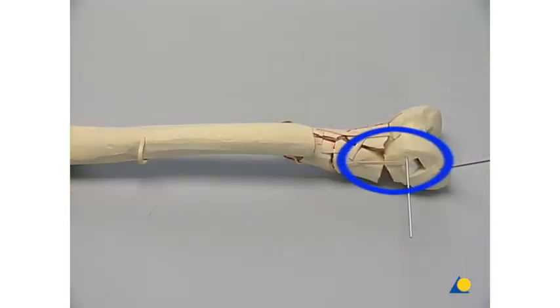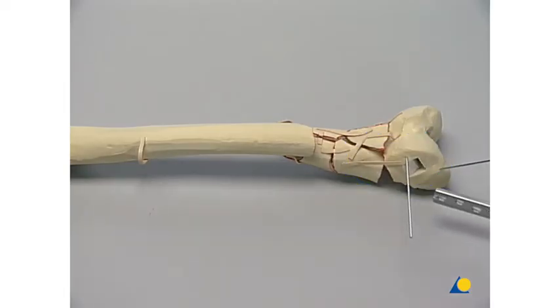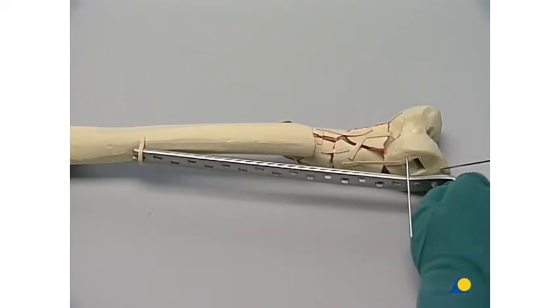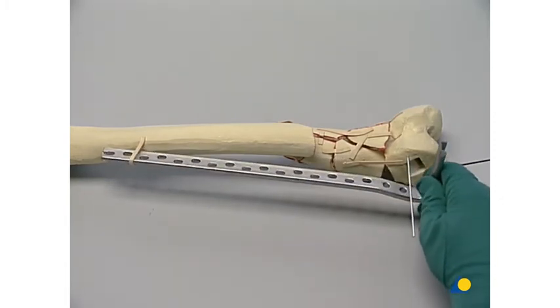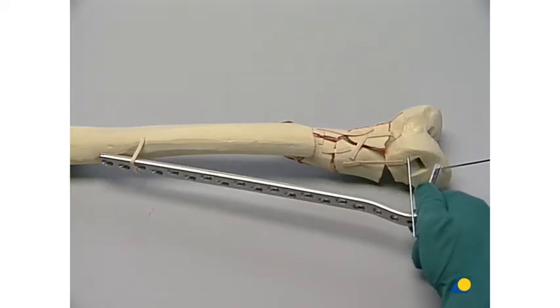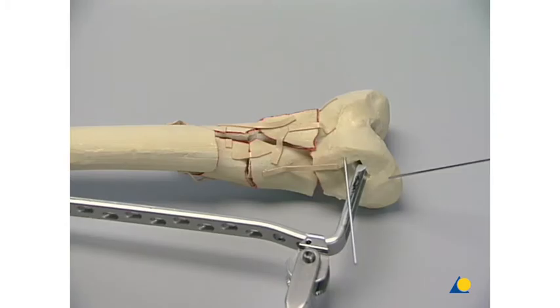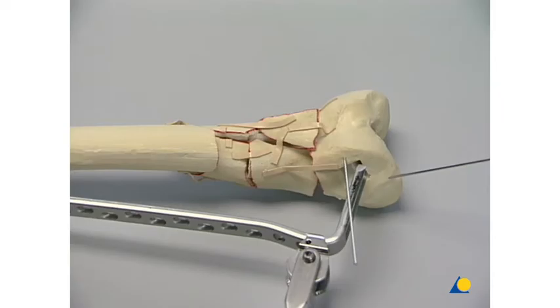A second 2.5mm K-wire has been inserted into the distal main fragment to serve as a joystick. The condylar plate is inserted from the distal direction under the layers of the vastus lateralis muscle with the blade facing in the lateral direction. When the plate is positioned as far proximal as necessary, it is carefully rotated 180 degrees in order to insert the blade into the bone. The shaft fragment must usually be dislocated slightly in the lateral direction. The plate-holding instrument is mounted onto the plate. The problem lies in the correct insertion of the blade into the prepared canal since the condylar plate stands away from the femoral shaft, which creates a divergence between the blade and the bone canal.